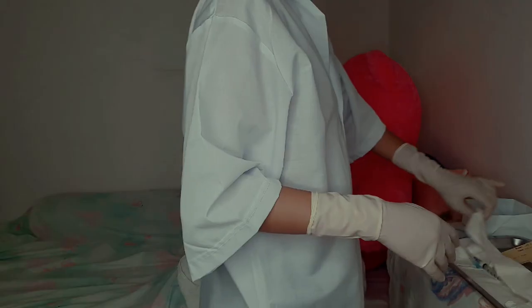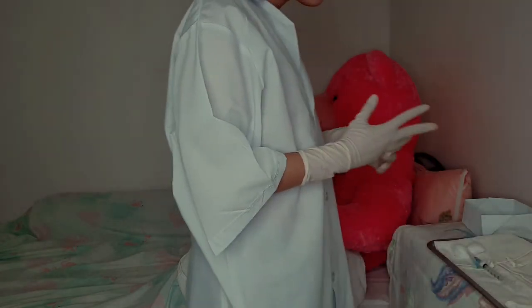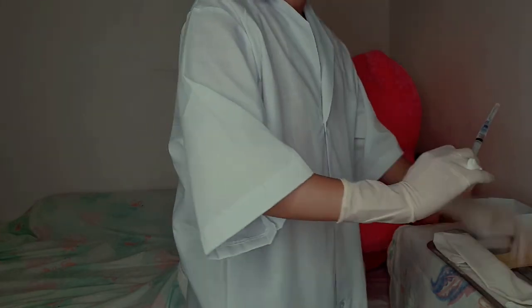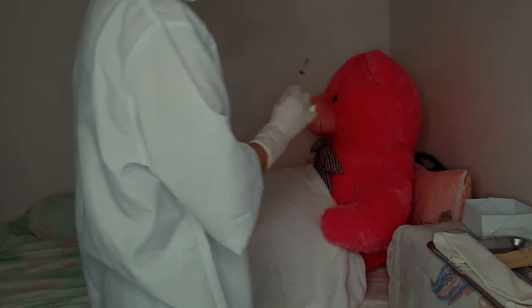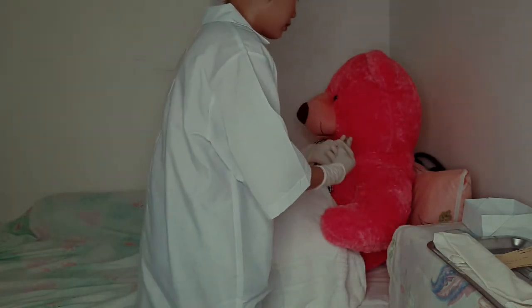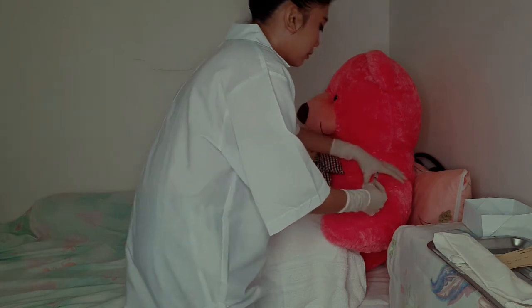Prepare cotton ball and syringe. Grasp the subcutaneous portion of the skin and subcutaneous tissue between thumb and finger of the non-dominant hand. With the right hand, hold the syringe and inject.